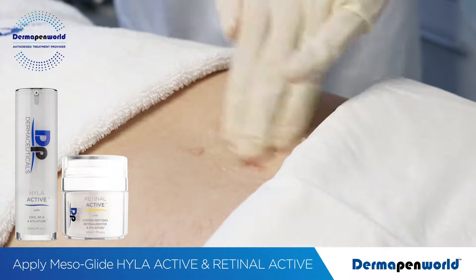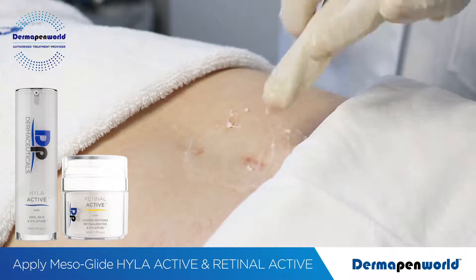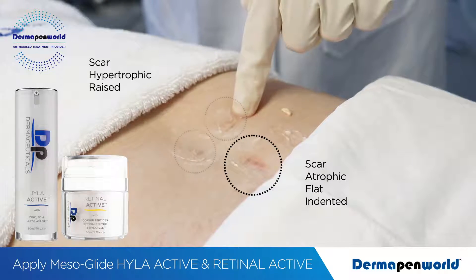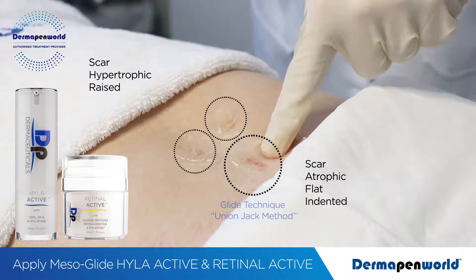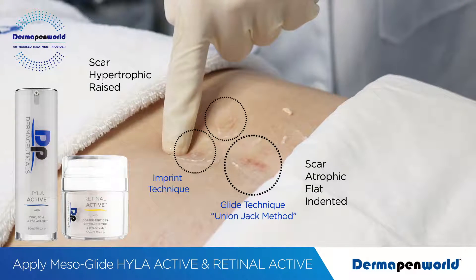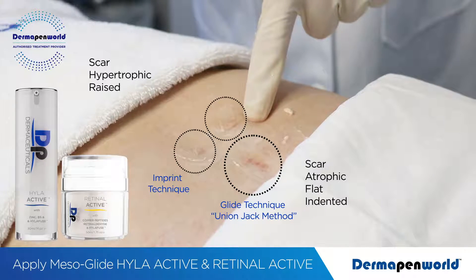Apply the Retinal Active and Hyla Active Mesoglide to the scar treatment area and using your fingers feel and determine whether the scar tissue is atrophic, as we see here, or slightly raised or hypertrophic for these two scars here. We can use a gliding technique for the upper area, but for these minor hypertrophic scars we can use an imprinting technique and go in at a multiple angle.